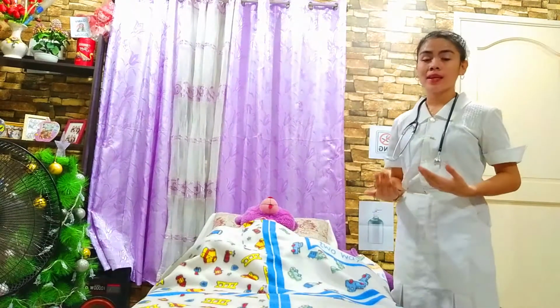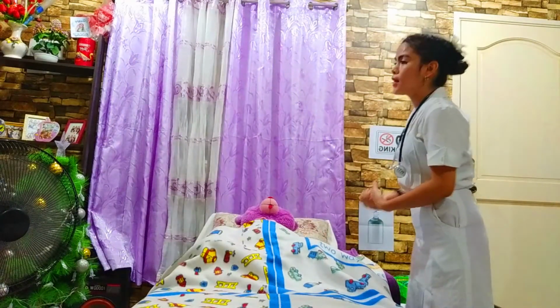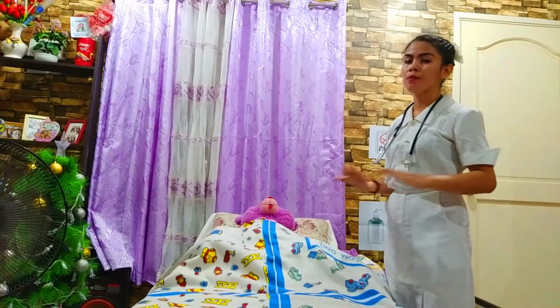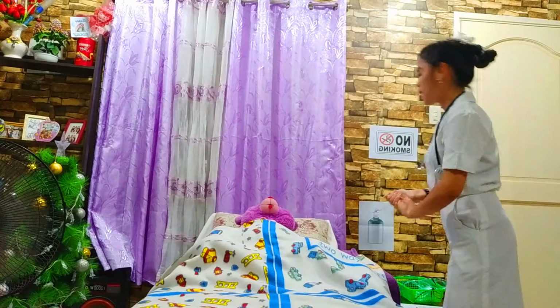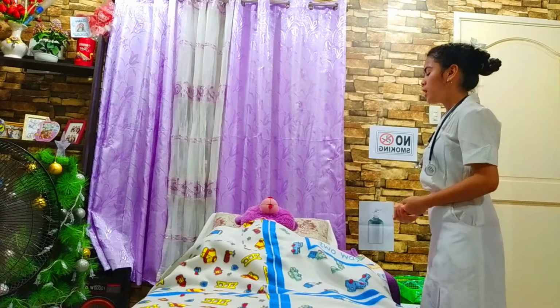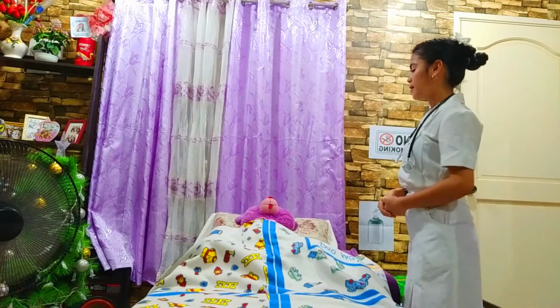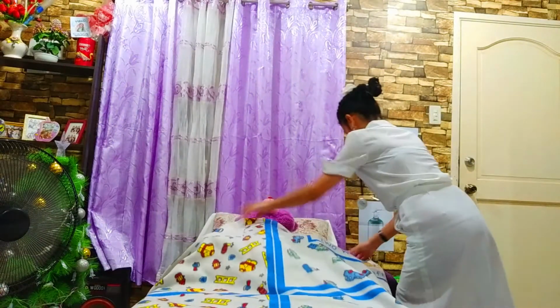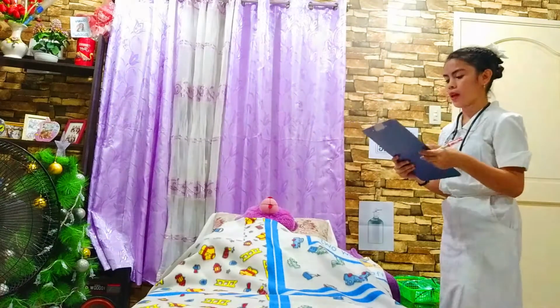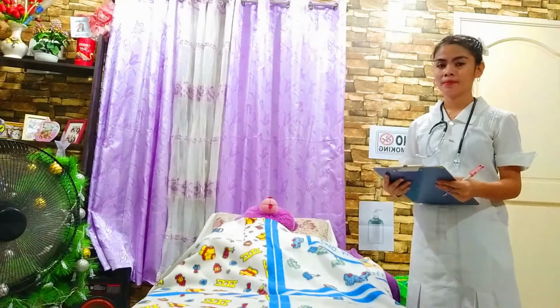Next, we need to assess the signs and symptoms of respiratory disease, if the client has hypoxia or any breathing problems and respiratory disease. And then we need to check the doctor's order, to make sure we are administering the oxygen to the right client. Then next, we need to wash our hands.